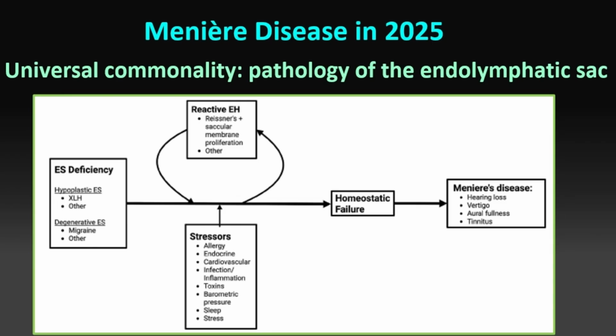So now we cannot see the endolymphatic duct or sac on imaging, definitely not on CT, not even really on 3T MR, or I don't know about 5T, 7T. You cannot see it. Sometimes if the sac is huge, you might see it with a little sediment level, but by and large, no. But the discovery in that paper with histopath and CT was that the endolymphatic duct and sac is surrounded by the vestibular aqueduct.